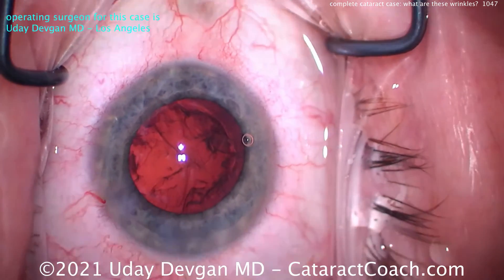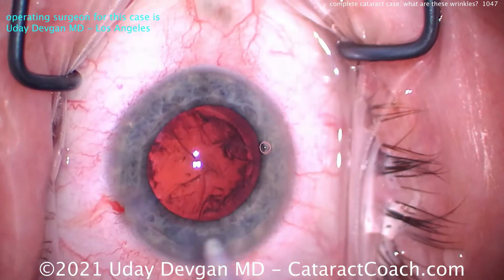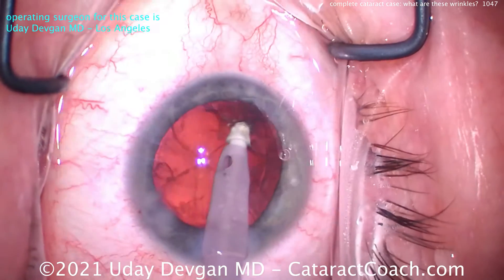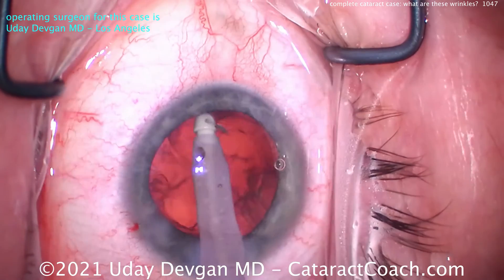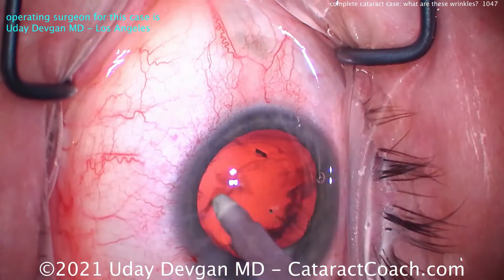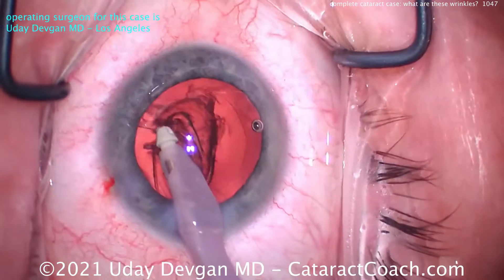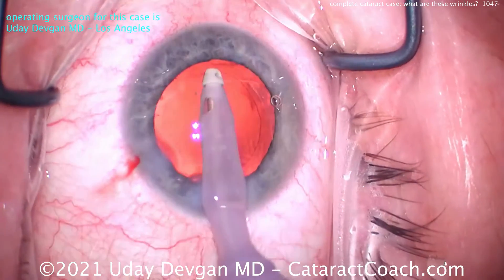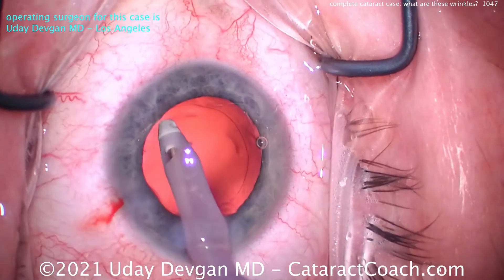Staff is going to switch this over for me to the IA tip — the IA probe — and do a coaxial cortex removal. If you're worried about zonular support issues — which I'm really not at this point — you just pay extra close attention to the capsulorhexis edge as you pull on the cortex. You don't want to see the capsulorhexis edge moving at all. In this case there's really no motion. Cleaning up the cortex pretty efficiently — looks great. Couple little fragments left, maybe a little capsule polishing going on, and there's something there that caught my eye. We'll try to get that out and it looks pretty clean.